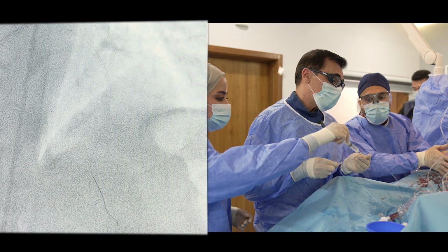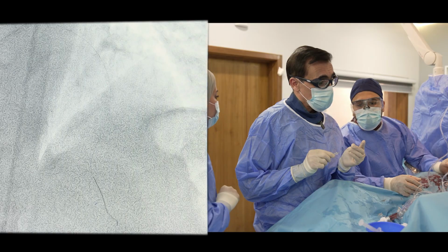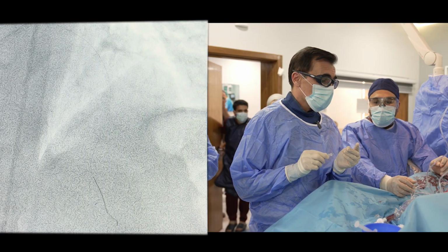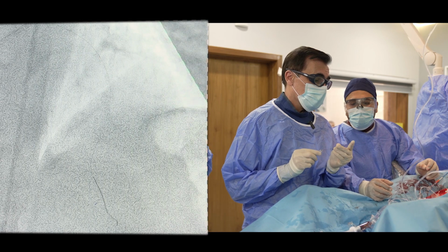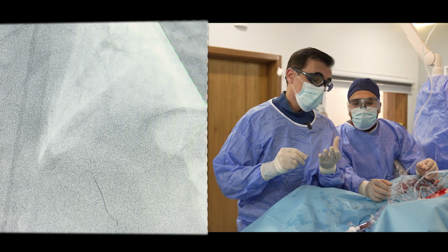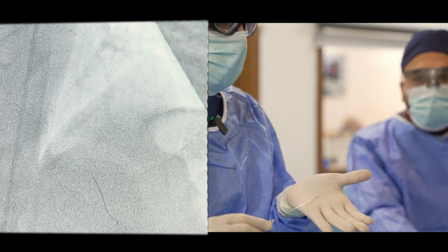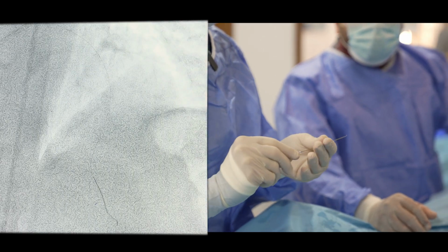So wiring the LAD was not difficult, and we anticipate some difficulty in wiring the circumflex. Probably we need some secondary angle. And that's what we are doing. If you see, you can focus.